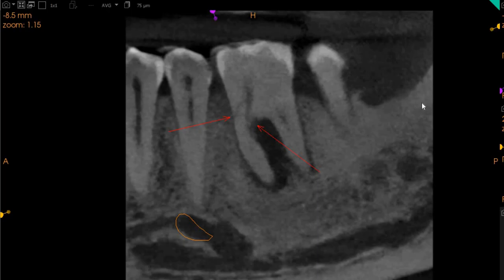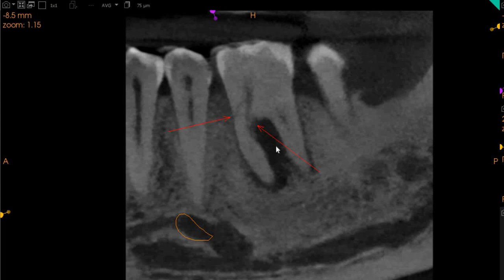On the sagittal view, which is the side-to-side view, on the buccal aspect of the mesial root there's a crack extending into the mesial aspect as well as the furcation area along with the roots of the mesial root. You can see a very clear peri-inter-radicular and a J-shaped radiolucency, as seen here.